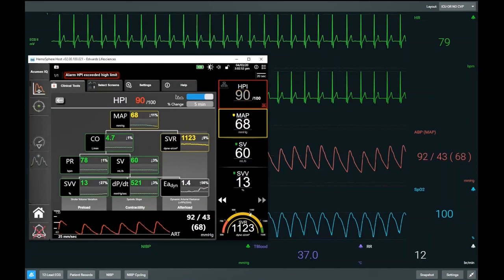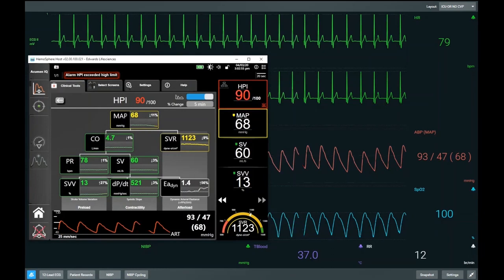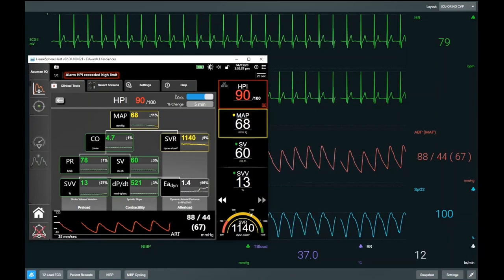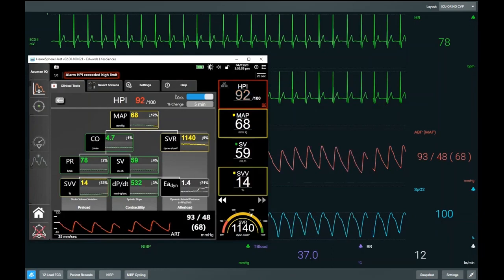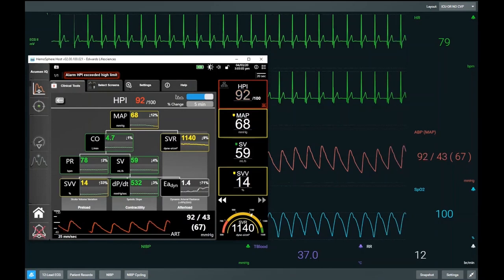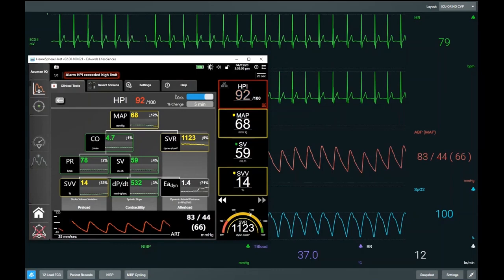If we review the physiology, our HPI is 90, so we're trending towards a hypotensive event. Blood pressure is still stable. Stroke volume remains relatively unchanged. But in terms of physiology, we see that our SVV is 14 and our Eadyne is 1.4.